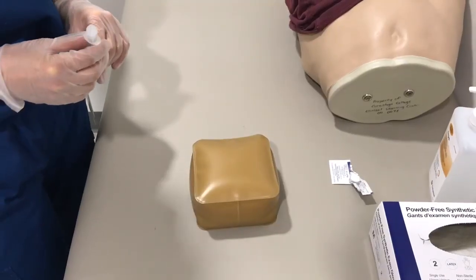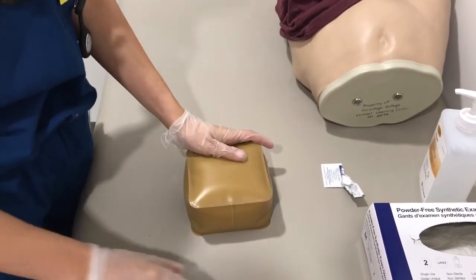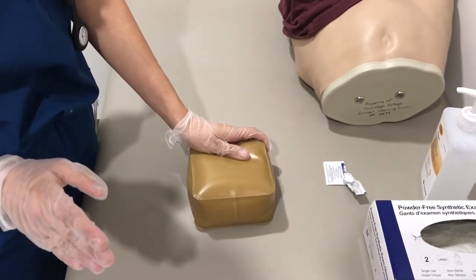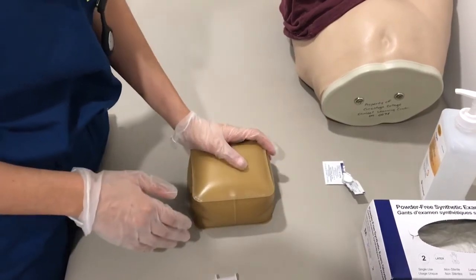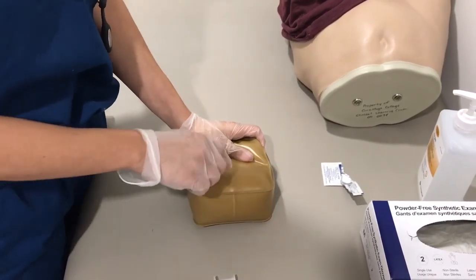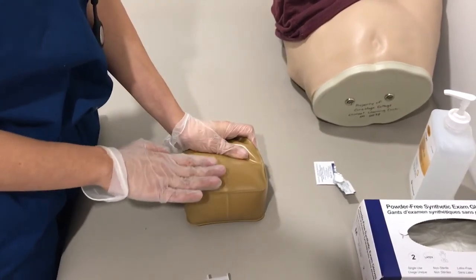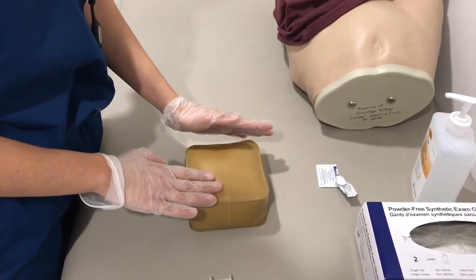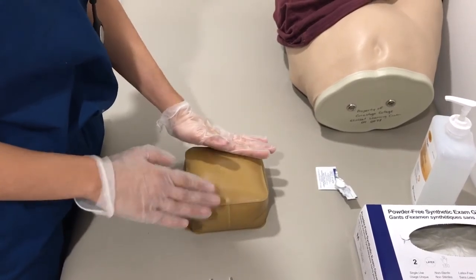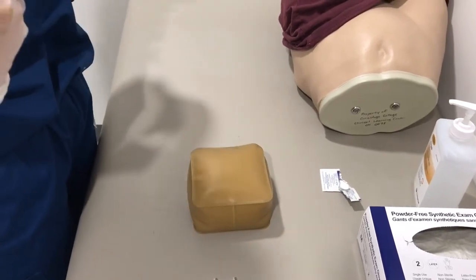So now that the alcohol is dry, I'm going to be performing the Z technique while giving the IM injection, just to go over that quickly right before I do it. We do the Z technique, which is going like this beside the area where you would want to give the injection, which would be here, and then releasing after you give the injection. This is just so that we don't have any medication leak up from the muscle.